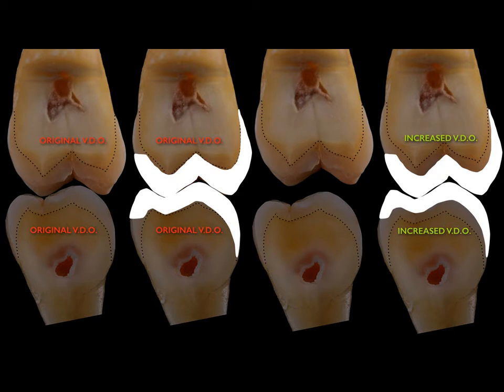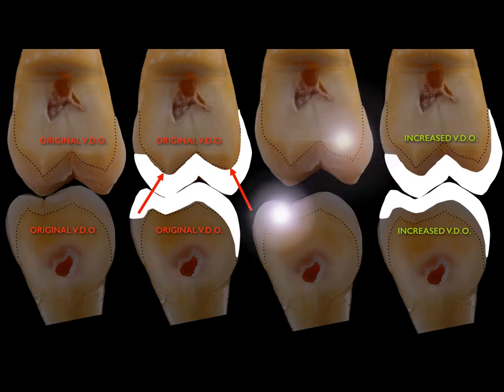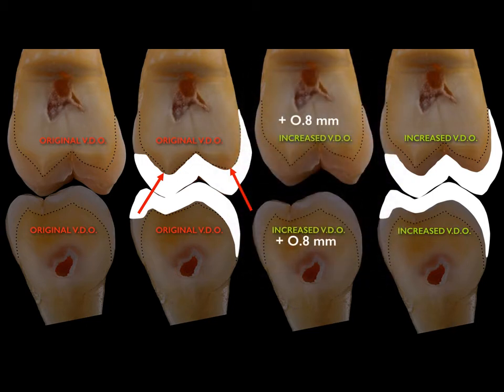So at this point, you see already that by increasing the vertical dimension, as you can see on the right part of the screen, you have the chance to really stay far away from the border. When you have an intact tooth with intact enamel, you stay out from the border between dentin and enamel that is marked by the black dotted line. So that's interesting. In this way, comparing the original vertical dimension with the increased one, is absolutely better because we really can save some tooth structure.